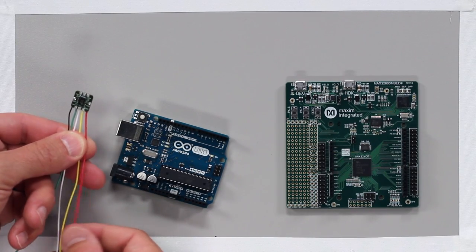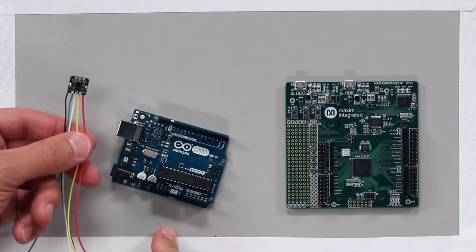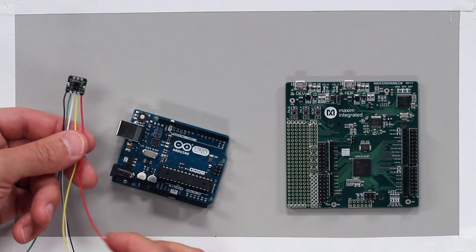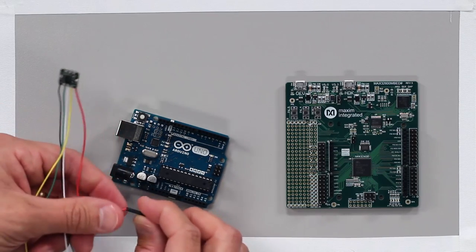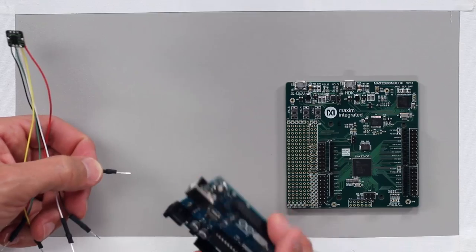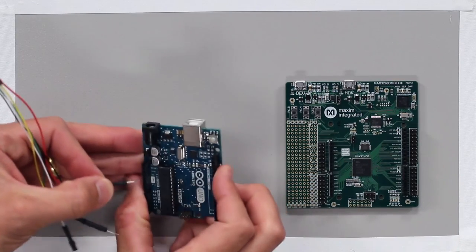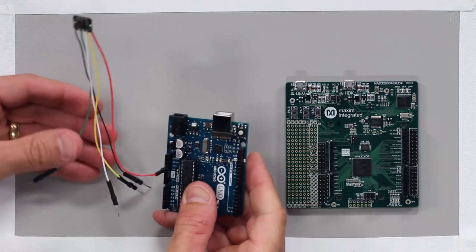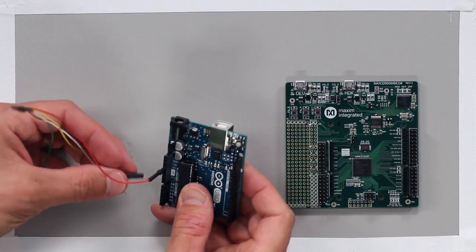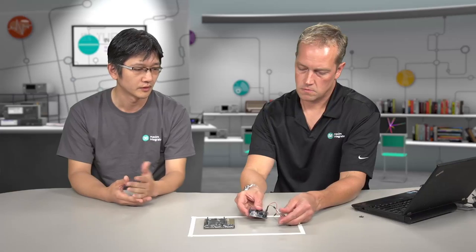And I'm just going to go ahead and put this right into our Arduino board. You want to start with Arduino, Gordon? Yes, start with Arduino. Okay, great. So the first one is the VIN, which would be 3.3. But Gordon, could I run it off of 5? Is there any limitation? Yes, you can run it off from 5 because we have the level translator and also the step-down converter on our reference design board. So you can support both 3.3 and 5-volt logic.